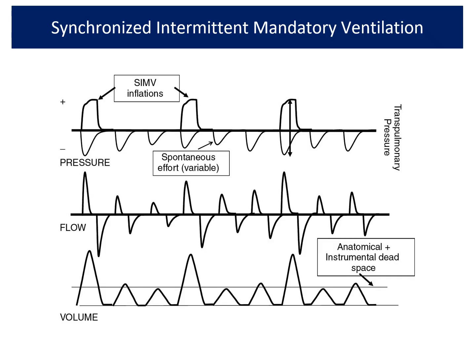So this is problematic because the 600 ml is going to cause ventilator induced lung injury. High tidal volumes will also cause diaphragmatic dysfunction, and now even the neuronal signal will be a little bit confused. Whether the patient is having high respiratory drive or low respiratory drive, the brain will be confused. So this is the worst way you would want to wean a patient.